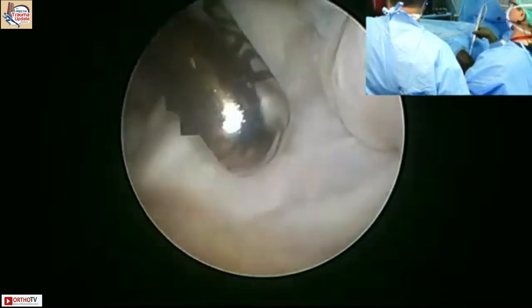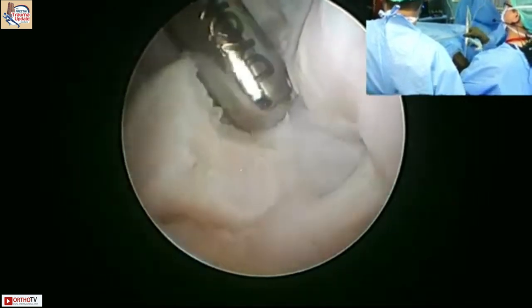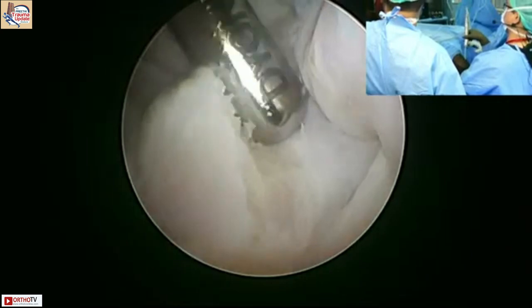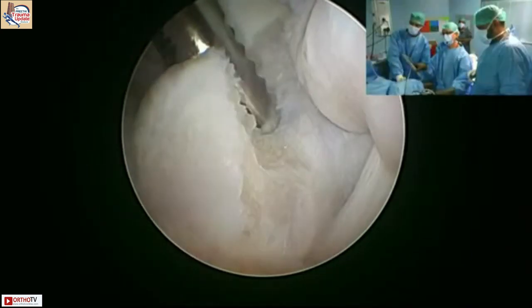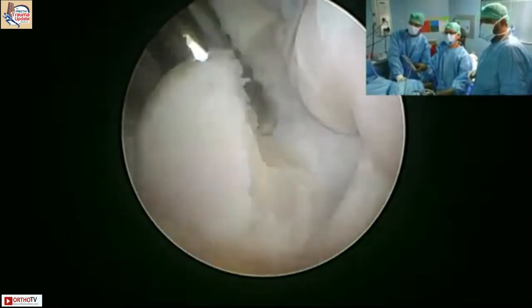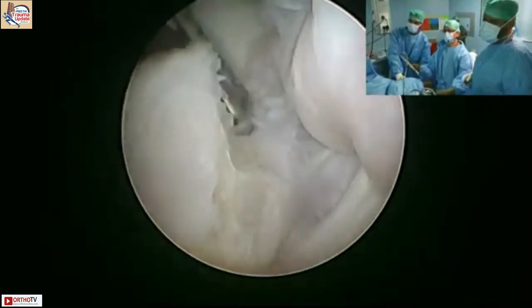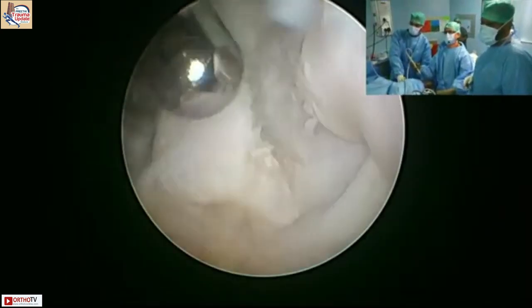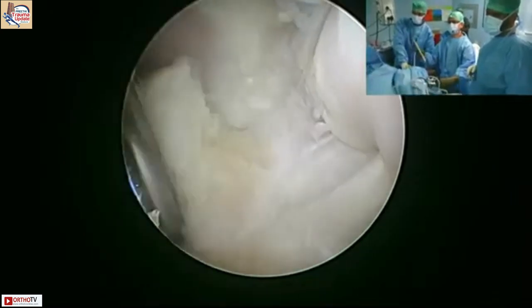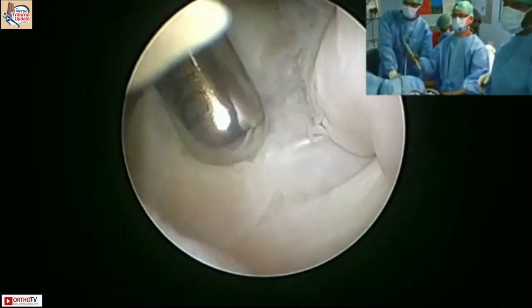Which according to you is the most difficult area to access with the scope? The posterior, because you're going close to the triceps and the nerve. Now, so you can see it, I can pretty much eat this up. It's a soft body. So if I don't have a grasper at times, you can pretty much eat this up, but we'll remove it. So how much is left? We still have stuff here.